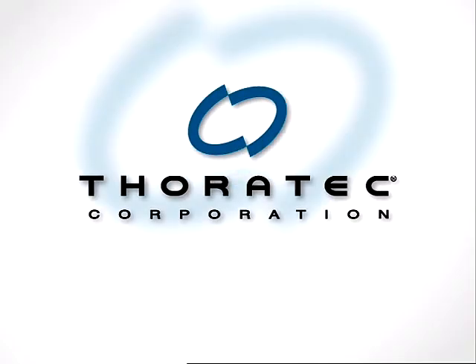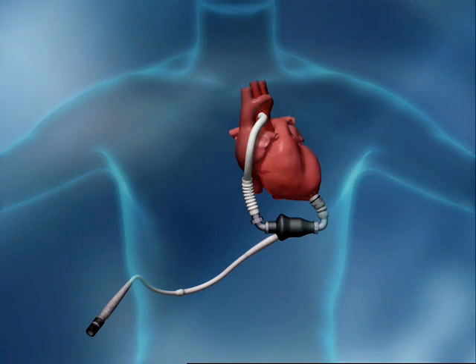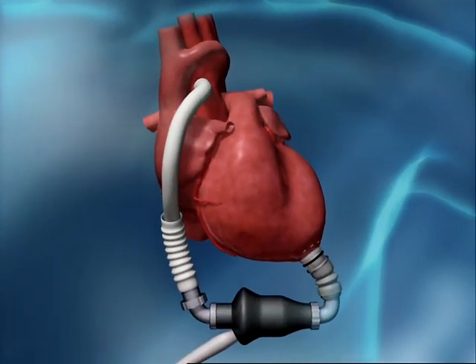Thoratec, the leader in mechanical circulatory support, introduces the HeartMate 2 Left Ventricular Assist System. The HeartMate 2 is a small and quiet advanced blood pump designed for improved outcomes with a wide range of late-stage heart failure patients in need of reliable, long-term circulatory support.